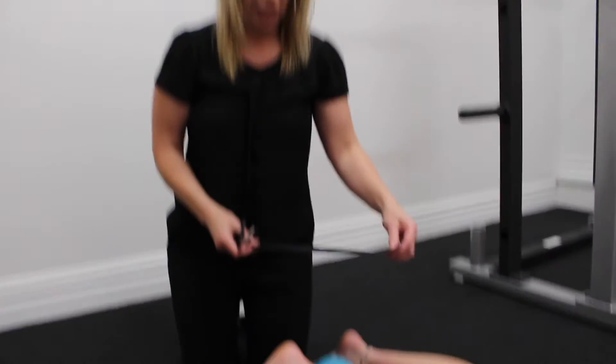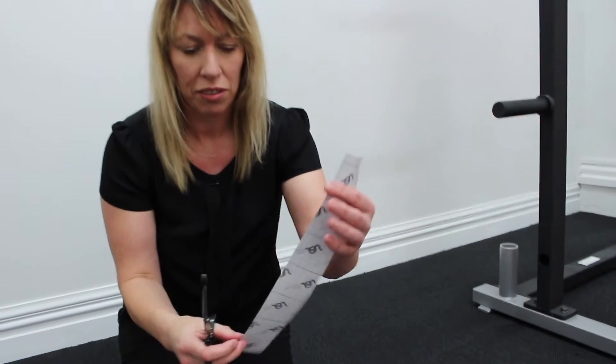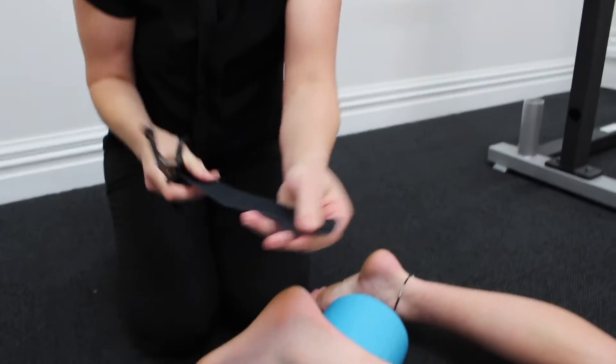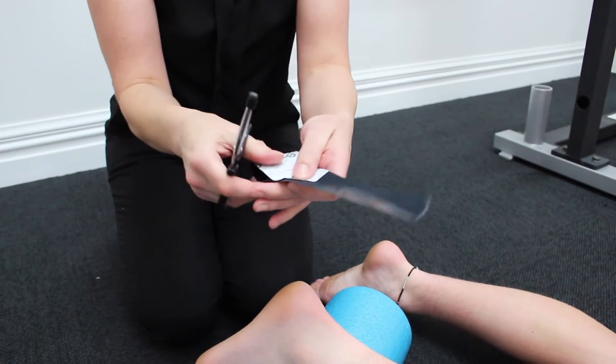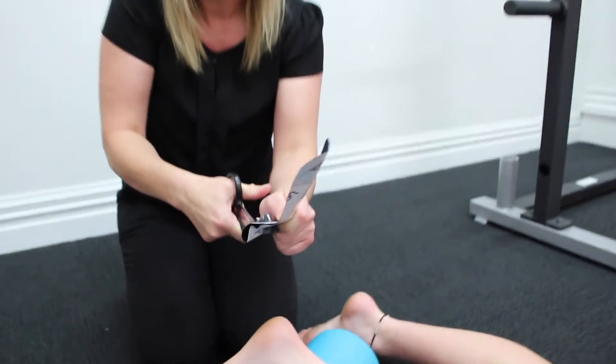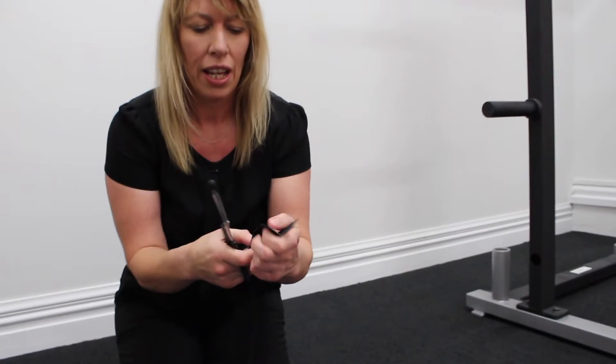I'm going to tape Tian's calf for his Severs disease. We've got a straight length of kinesio tape. I'm going to cut the edge to curve it at the bottom, then fold the top half over, cut it straight down the middle, and curve these two ends.